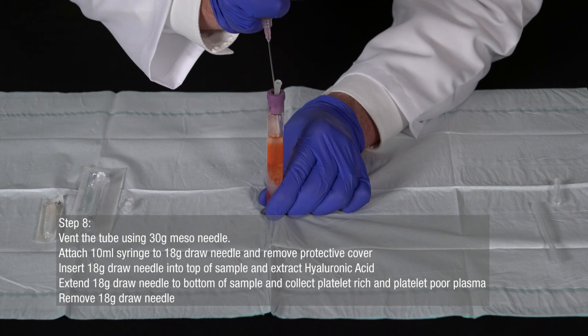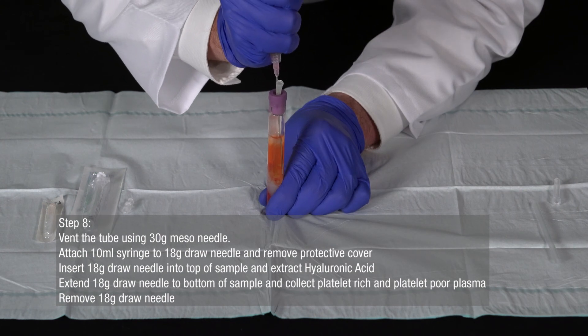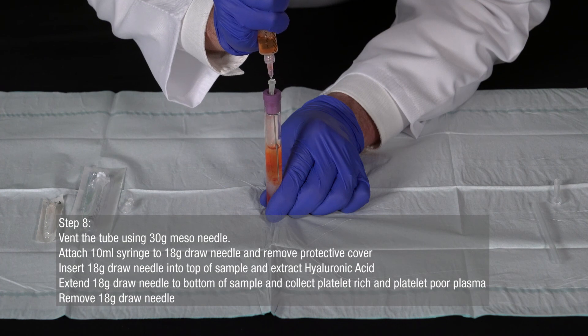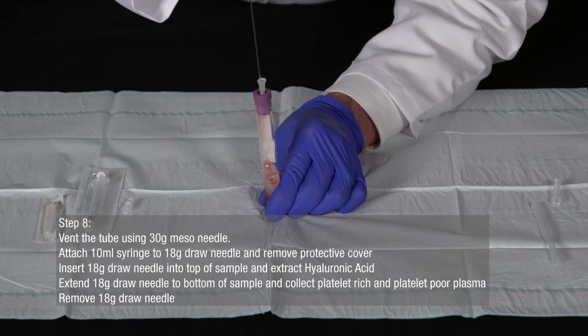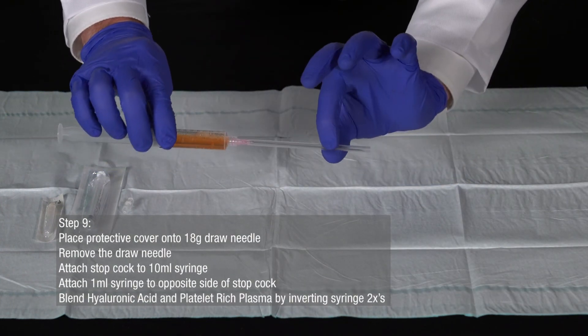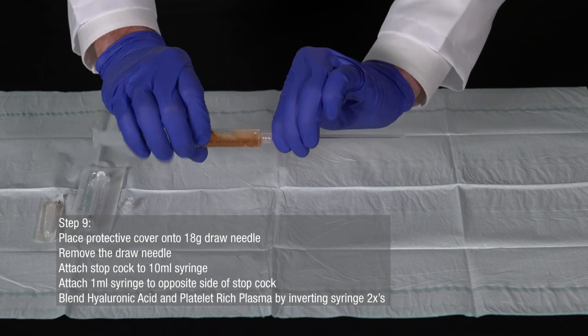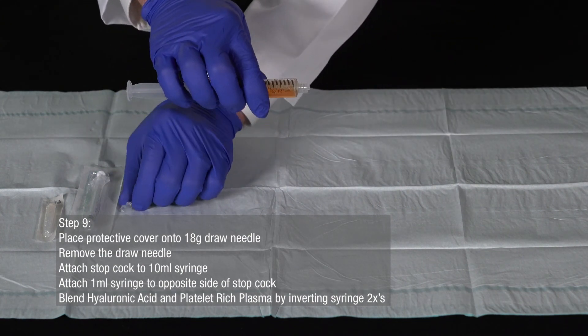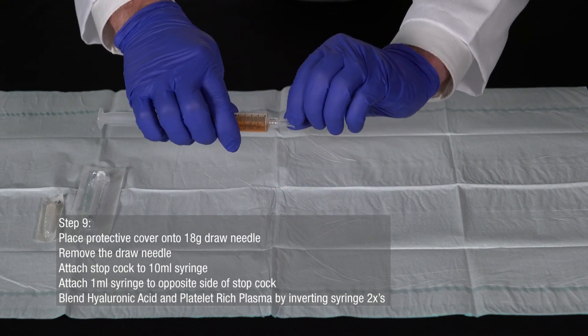Then insert the 18-gauge draw needle to the bottom of the sample just above the gel separator to collect the platelet-rich and platelet-poor plasma. Remove the 18-gauge draw needle. Place the protective cover onto the 18-gauge draw needle and remove the draw needle by twisting it from the luer lock connector on the 10-milliliter syringe. Attach the stopcock to the 10-milliliter syringe.